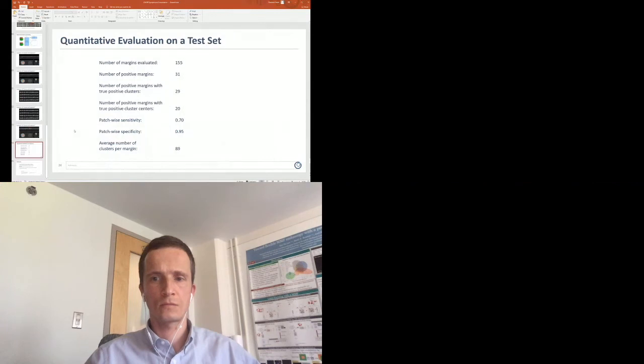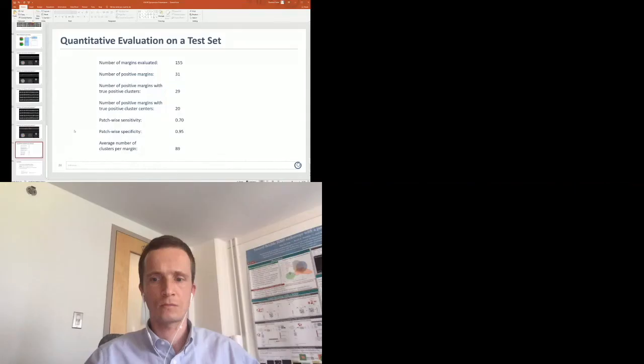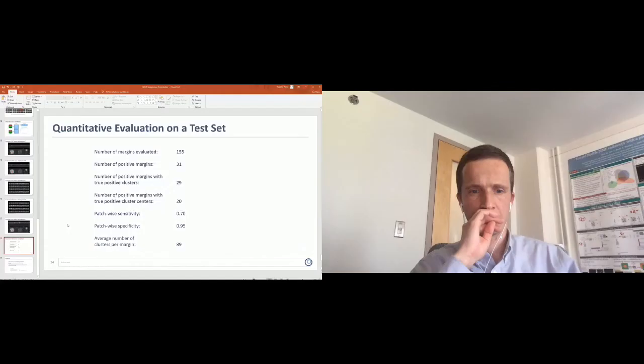We did a quantitative evaluation on a test set of 155 full margins. We had 31 positive margins in the test set. What's important is that we have 29 margins identified with true positive clusters, and for 20 of them the thumbnail presented to the user was indeed a true positive.